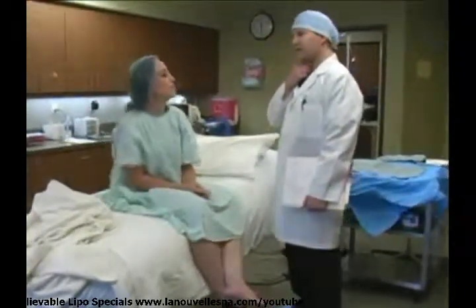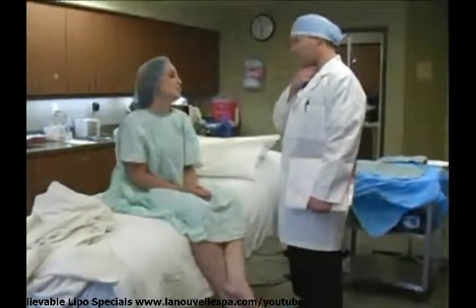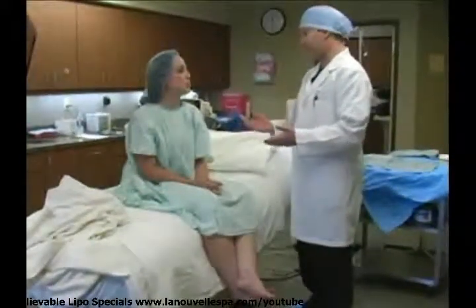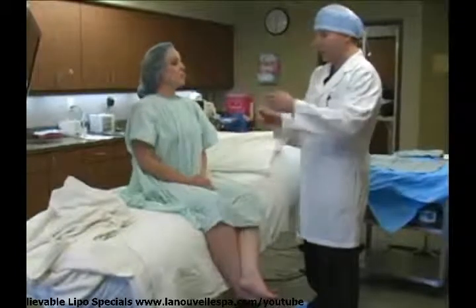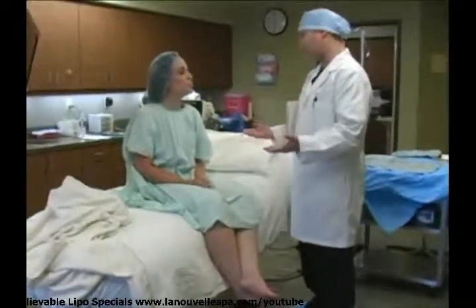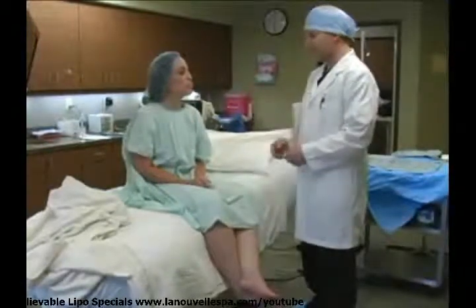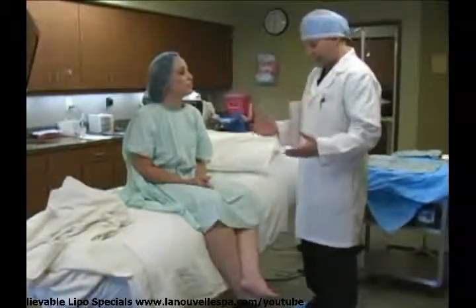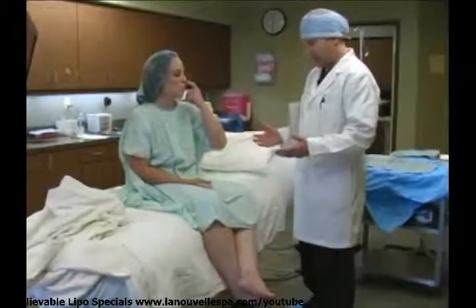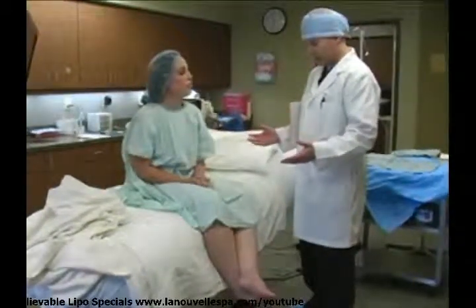It's interesting with liposuction, the way that it's evolved over the years. Historically in surgery, a lot of patients like you probably would have required cutting off the skin. We were able to get that skin to come up maximum amount with a minimally invasive procedure. So today, I know we're going to do some different areas. We're going to take a look at your calves and ankles.